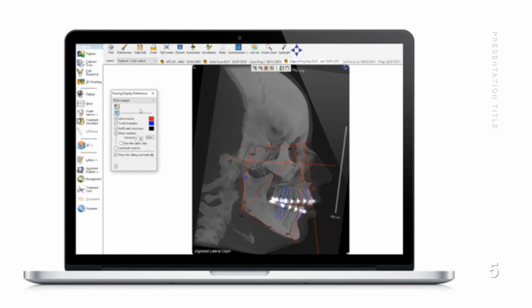However, there is no standardized software currently in use to relieve the burden of actual landmark identification from the clinician. This task is labor-intensive and time-consuming, taking approximately 5 minutes per radiograph. But more importantly, it's also difficult and subjective, which introduces significant inter-observer variability to their interpretation. As a result, most clinicians will not even trace cephalograms in clinical practice, and instead choose to simply use the information available from a quick big picture glance at the image.